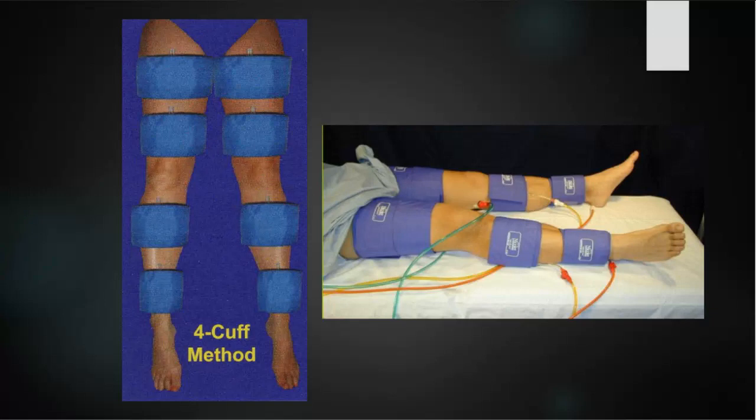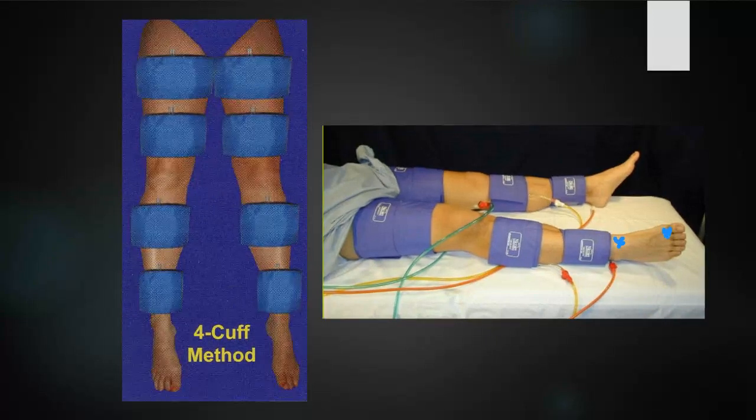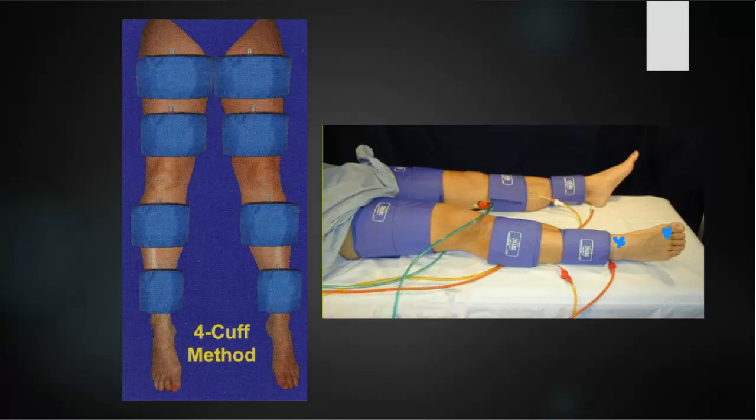Am I angling posterior? If I'm angling posterior to that ankle bone or that ankle joint, I'm going to get the peroneal. If I'm angling anterior, I'm going to get the PTA. Right? Or if I'm coming right here, I know I'm going to get my ATA. If I'm coming right here, I'm going to get my DPA. So depending on the site's protocol, you are going to keep your continuous wave Doppler in that specific location of the artery in the foot or the ankle, depending on protocol.